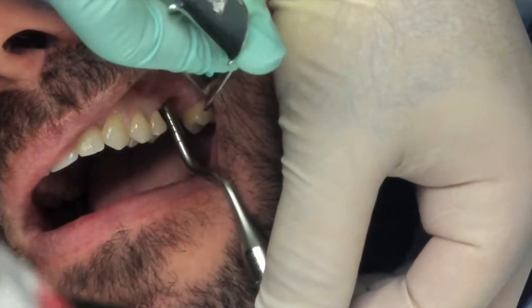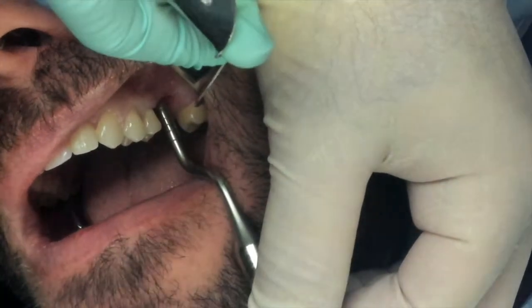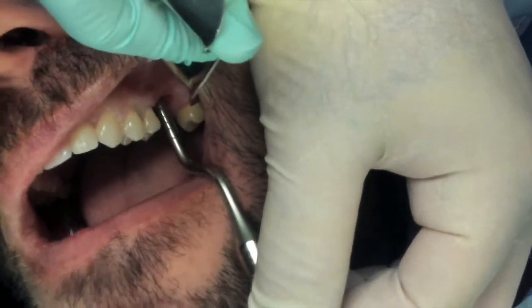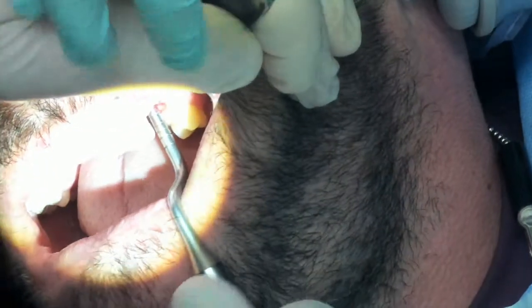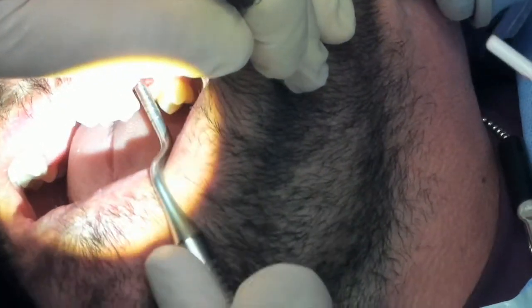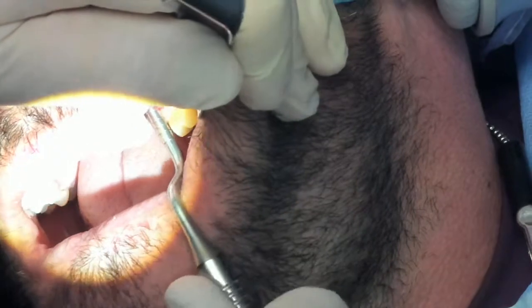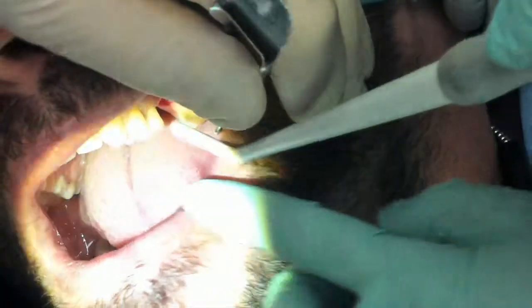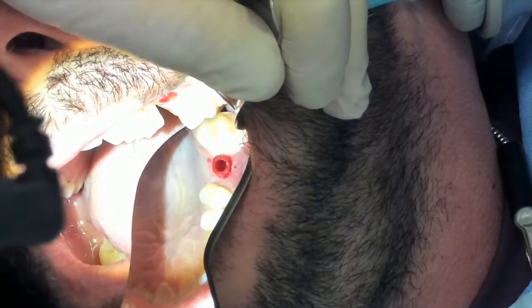All right, so now you're going to hear a little tapping, okay? So what we're going to do is give a couple little taps, do a little greenstick fracture. You okay? One more time. So we're going to step them again. We're going to go to the mirror for a second. And you can see the floor of the sinus is still intact, okay?